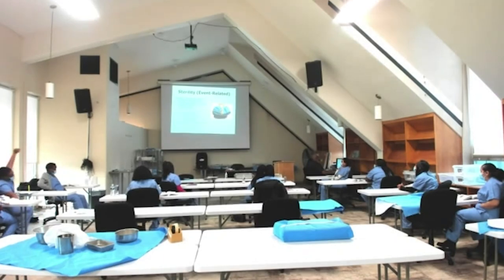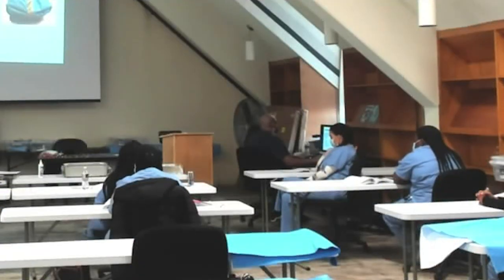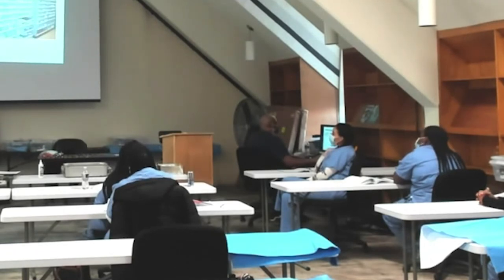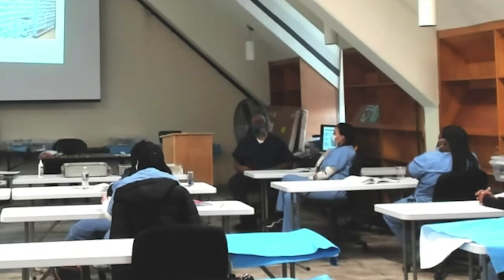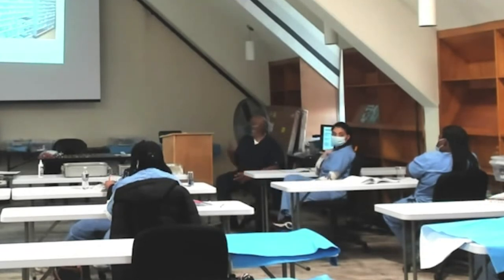So here are our concerns. We always look out for moisture, dirt, dust, physical damage. If you saw this tray, you would be 100% right to say, we need to do it over. Here's what some of the sterile storage areas look like, and I'm going to leave those temperatures there. We are going to take a break because we've been nonstop since 3. We'll pick this back up and get back to the hands-on.